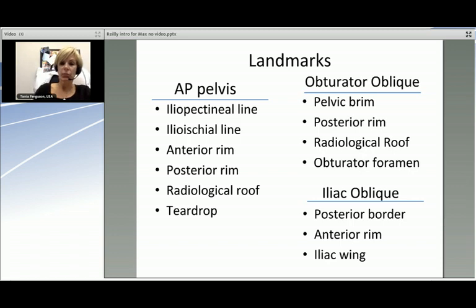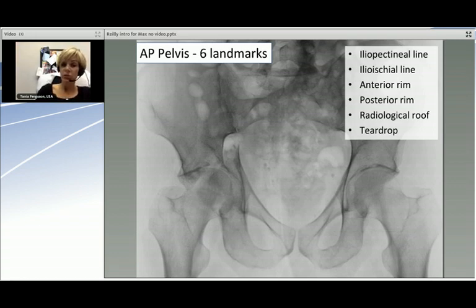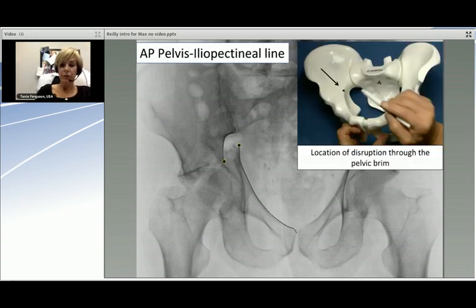From the information you've already learned, you've probably come up with the fact that there are specific radiographic landmarks that we evaluate every time on the three standard films: the AP pelvis, the obturator oblique, and the iliac oblique. What we're now going to do is take that information and apply it to an injured radiograph, using the same approach — understanding the six landmarks, starting with the AP pelvis — for example, understanding that the iliopectineal line disruption indicates a disruption in the pelvic brim. Dr. Riley will take you through this step by step.